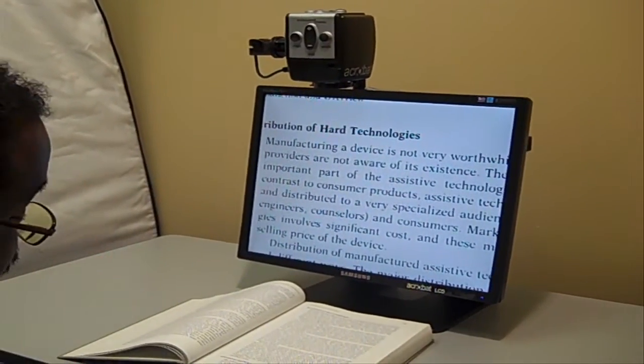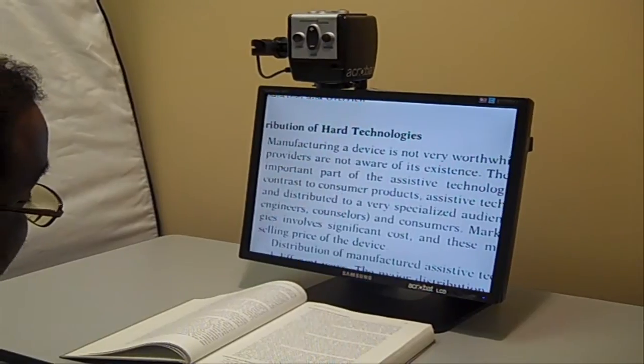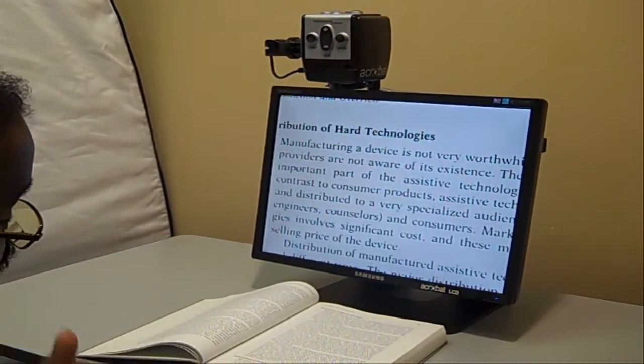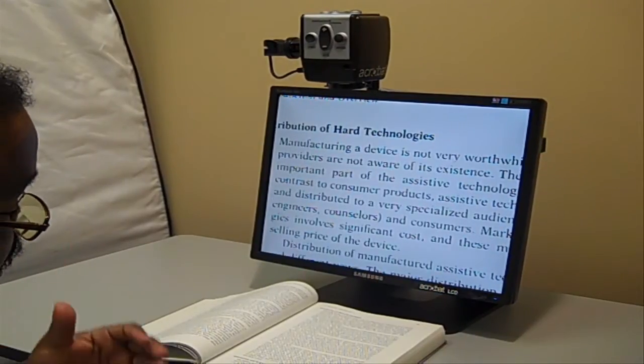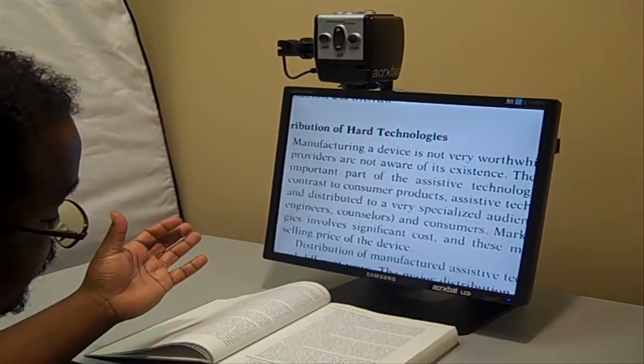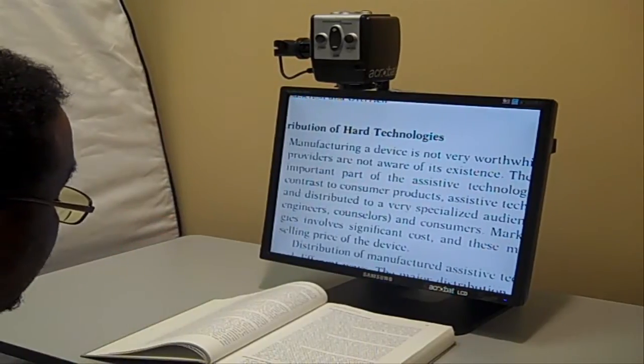I really love this piece of equipment. It's very portable. I can take it to class with me, take it to church, anywhere I need to go where I need to do some type of reading or looking at materials — looking at the text, the blackboards, or any of those types of things.